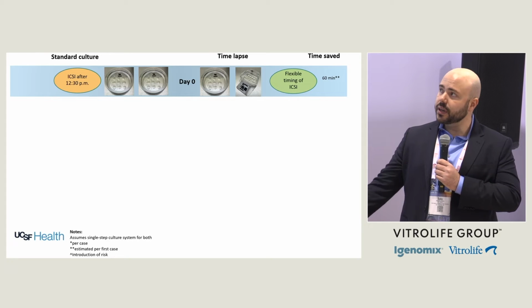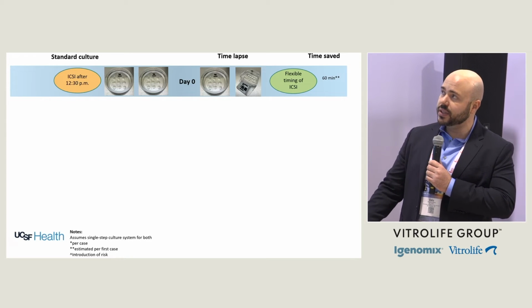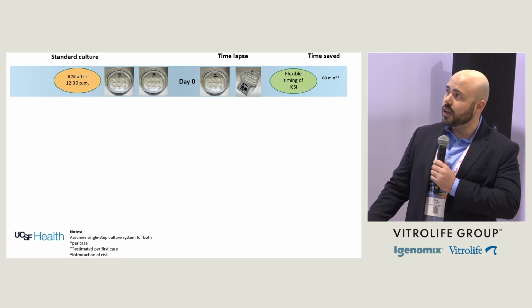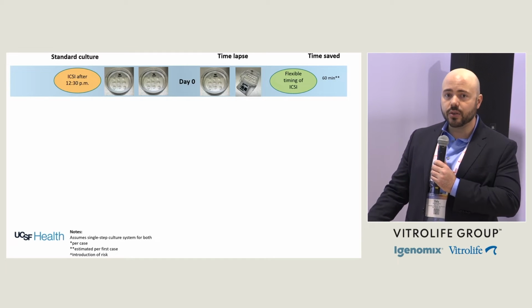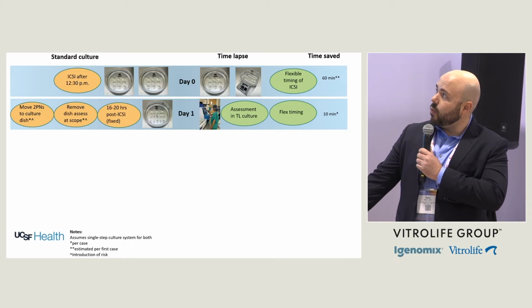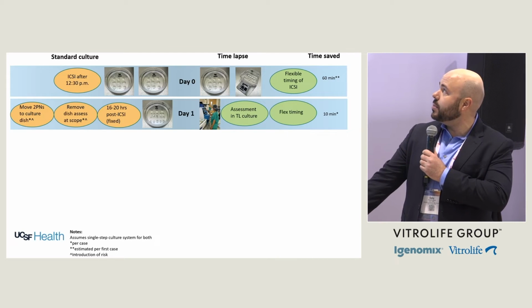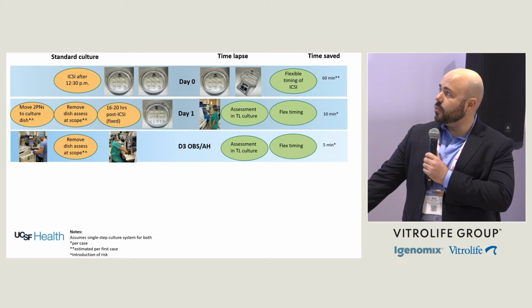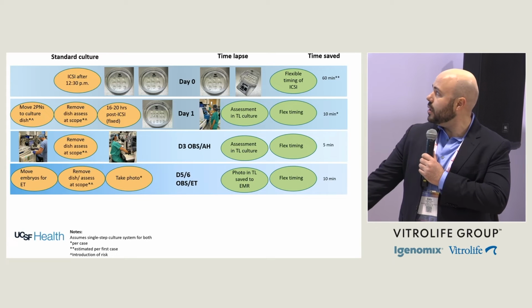So for example, here is just the table that we had set, which is a standard culture versus a time-lapse, and how long can you save between your standard culture and also your time-lapse system. That is for day 1. You have your 10 minutes saving.